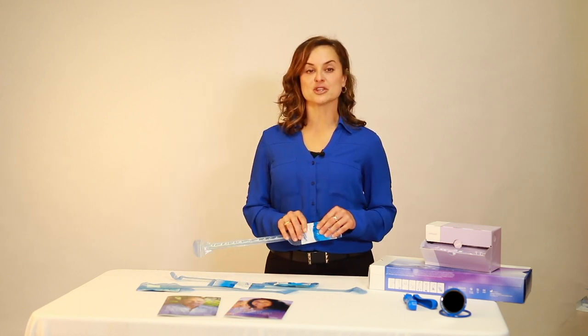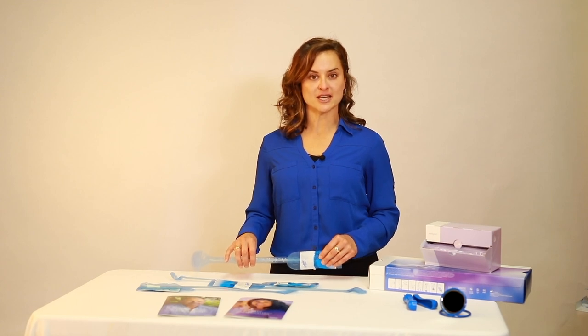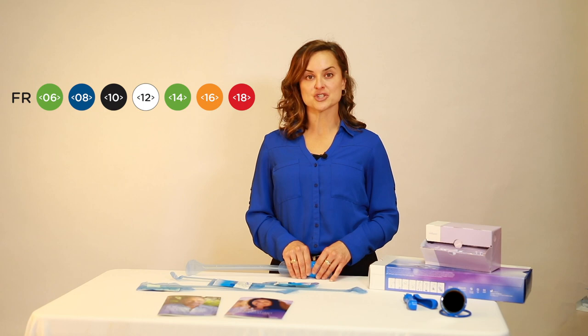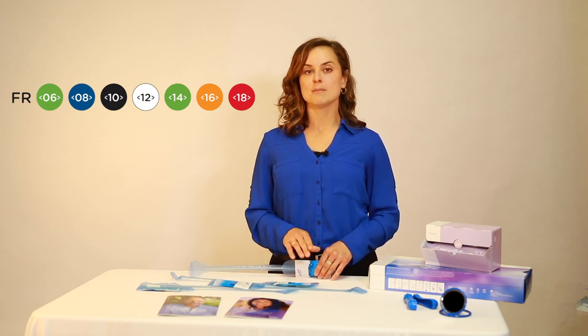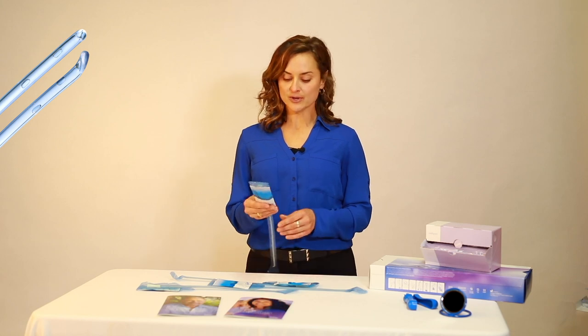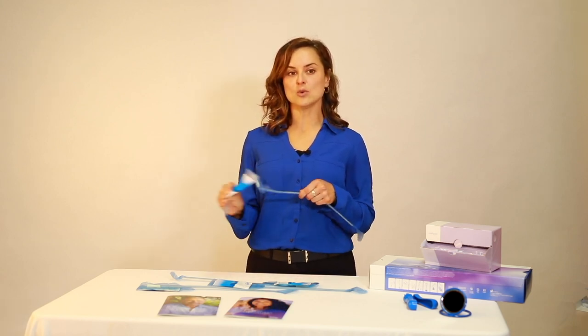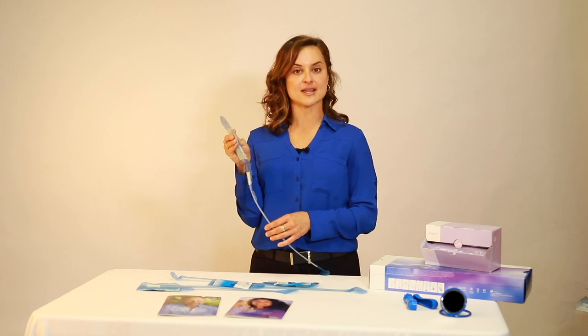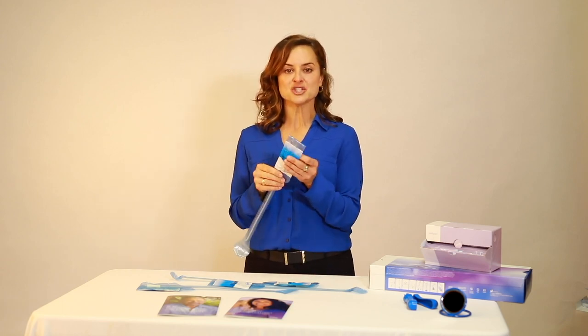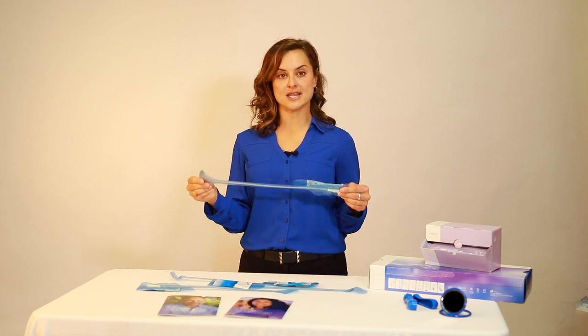Lofric Primo is our ready-to-use Lofric catheter that comes in three lengths — 6 inch, 8 inch, and 16 inch — as well as diameters ranging from 6 French through 18 French, most in both straight and coude. The Lofric Primo is activated by a quick squeeze of the sterile water sachet and has a 30-second soak time. The packaging can also be used as an insertion grip for a no-touch technique.